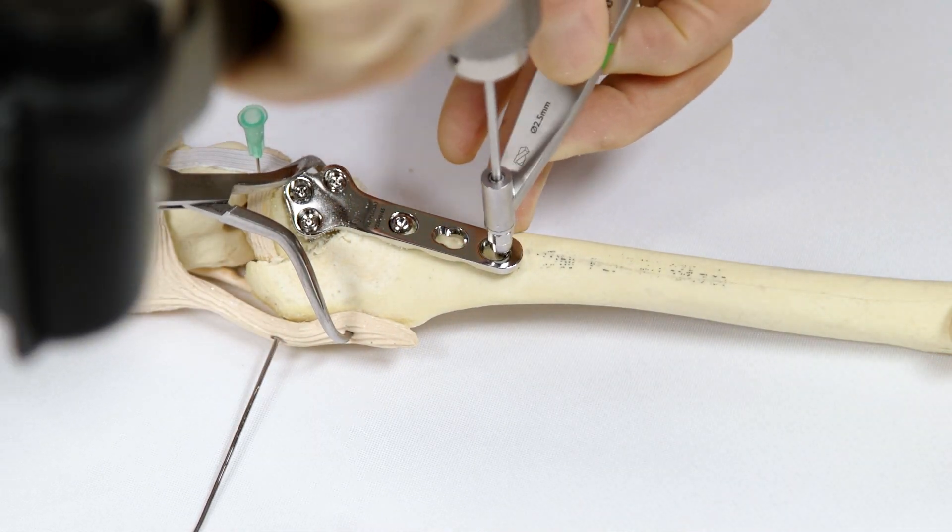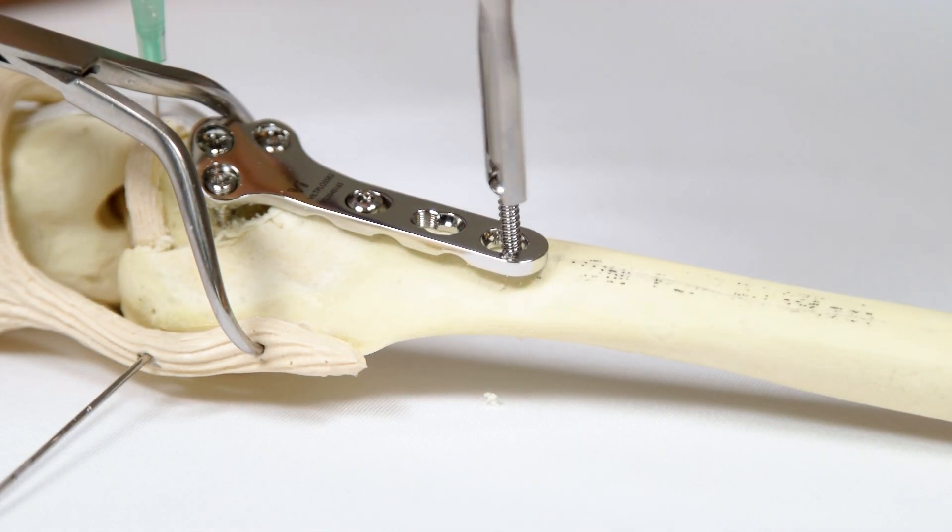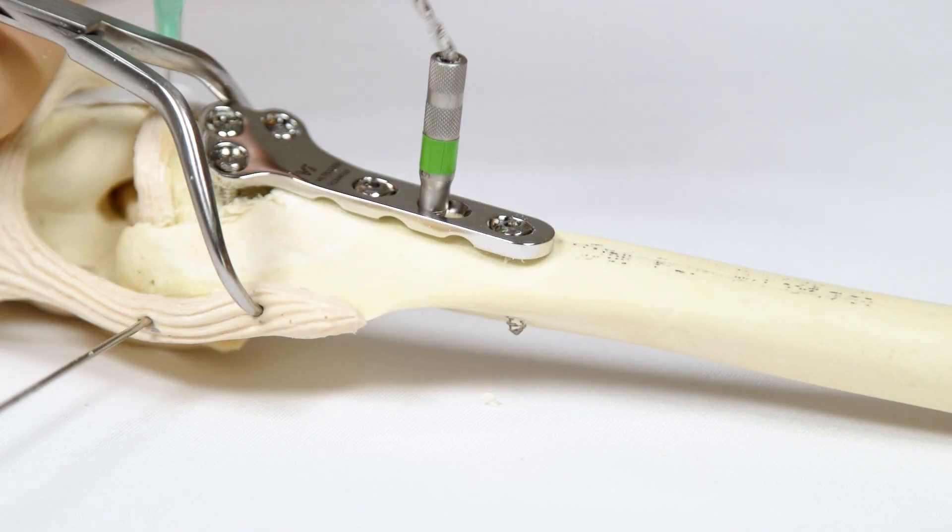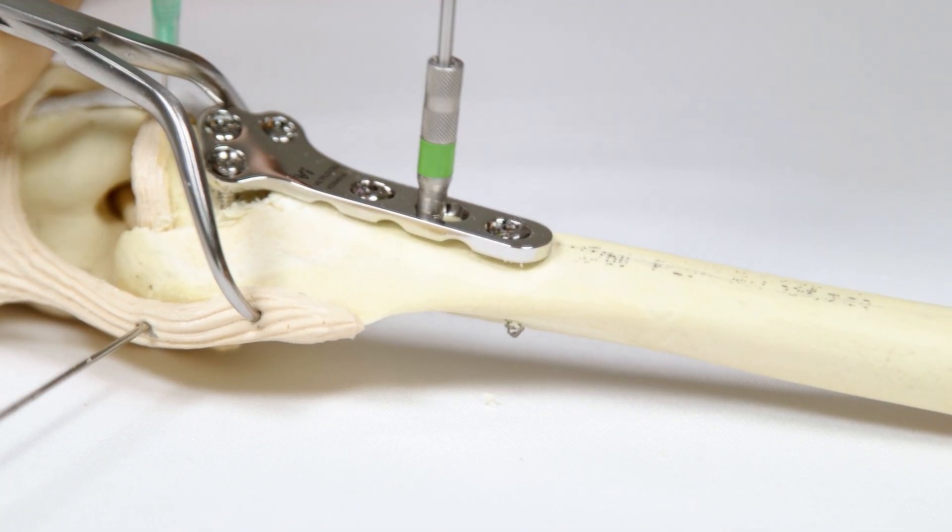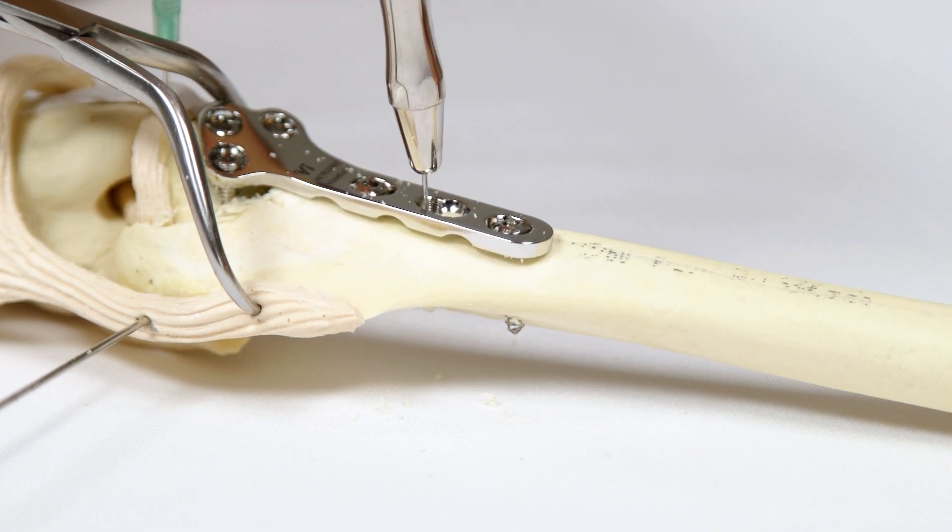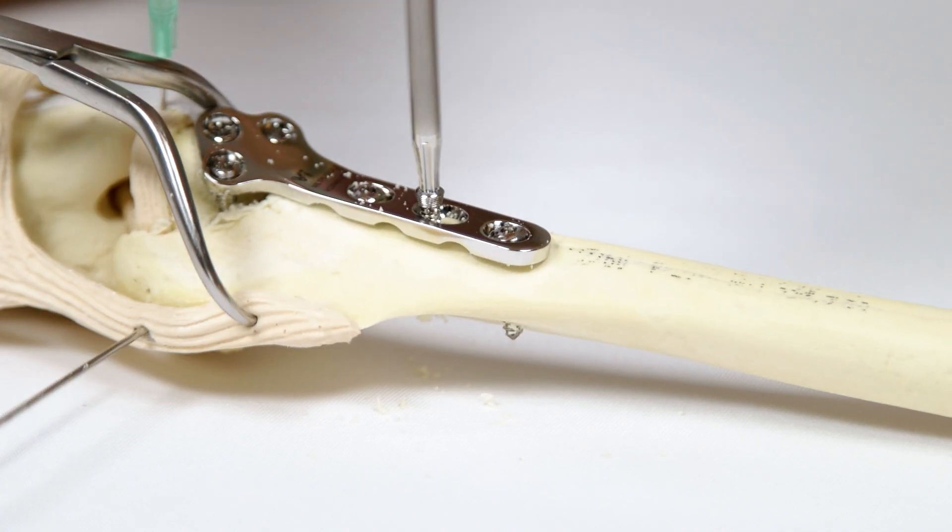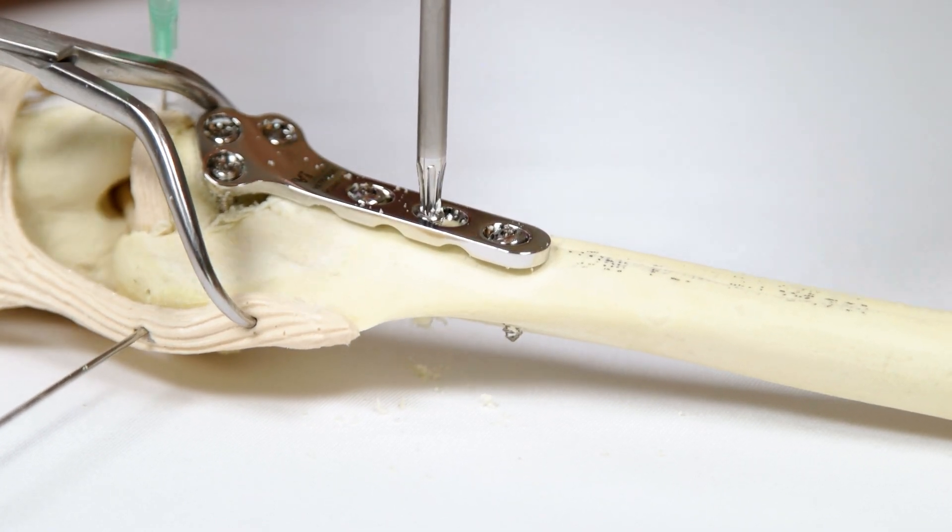The most distal screw in the plate is then placed. A cortical screw in axial compression mode is used here. Finally, the remaining screw is placed in the straight section of the plate. This plate hole can accept either a locking or a cortical screw. It is recommended that a locking screw is placed here for maximum construct security.